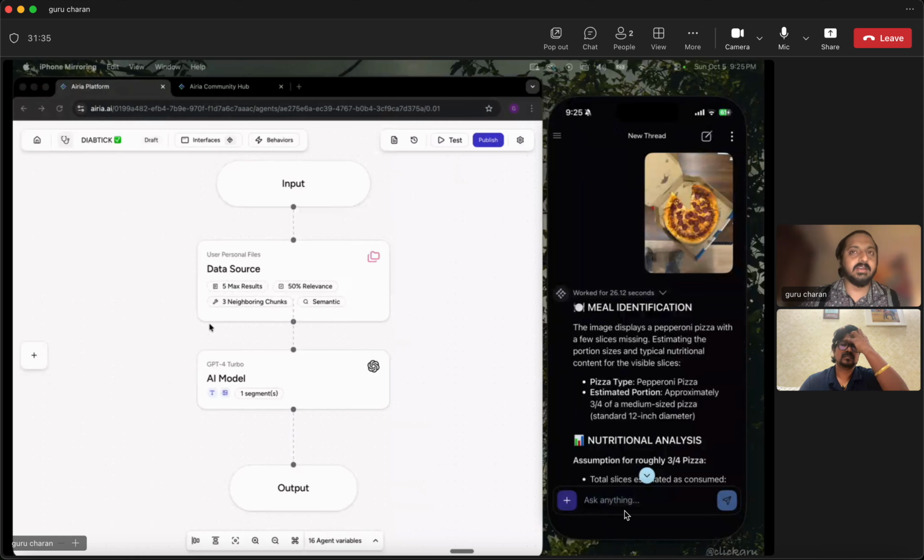That would go through a data source pipeline doing a RAG, which would draw from FDA approved calculation methodologies and international diabetic organization based research data on food consumption and insulin levels. It will go through all those documents with the context and try to extrapolate the calculation for the insulin, and then provide all those contexts to the AI model, in our case GPT-4 Turbo.